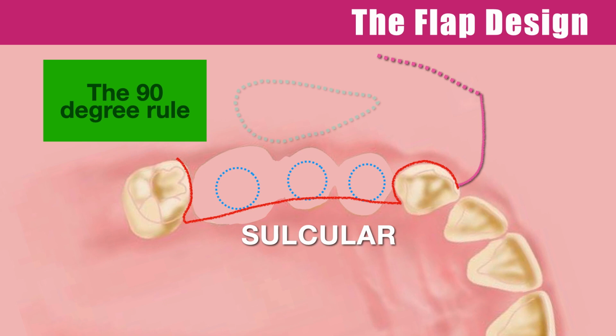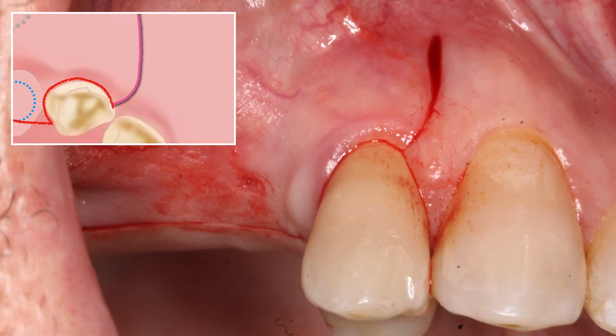It was a remote incision, one tooth away, but it was needed to avoid the area that we have to expose that will have some form of low bone volume, therefore defect sitting immediately underneath. So here is the initial incision design.